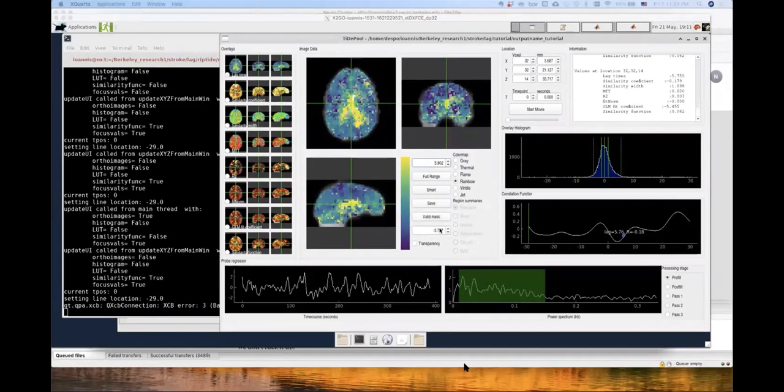You can play with the range or the color map here. In the middle right panel, you can see the distribution over voxels of these lag maps. The zero in this distribution is arbitrarily defined at the peak of the distribution, so as to allow easy cross-dataset comparisons.